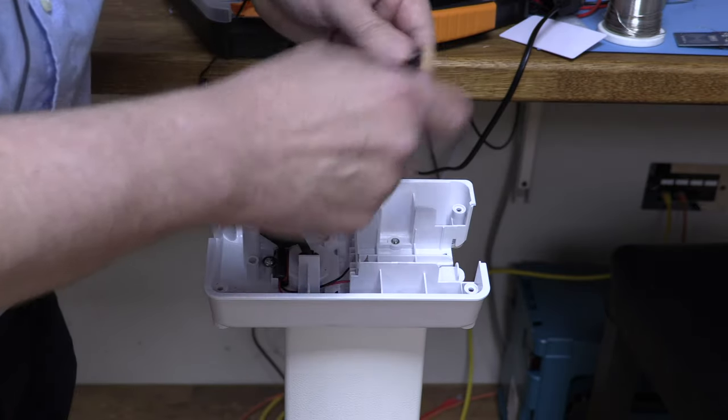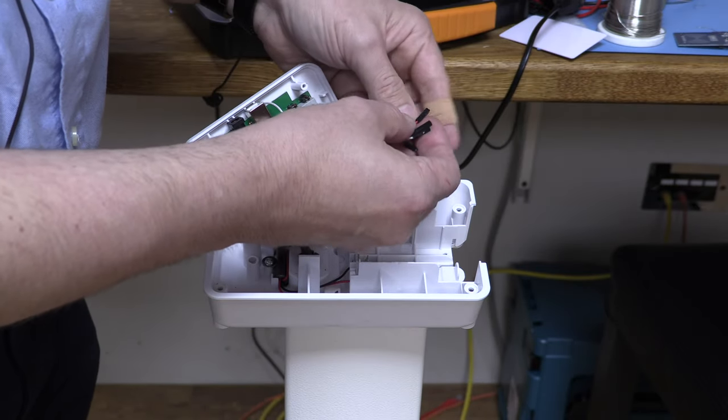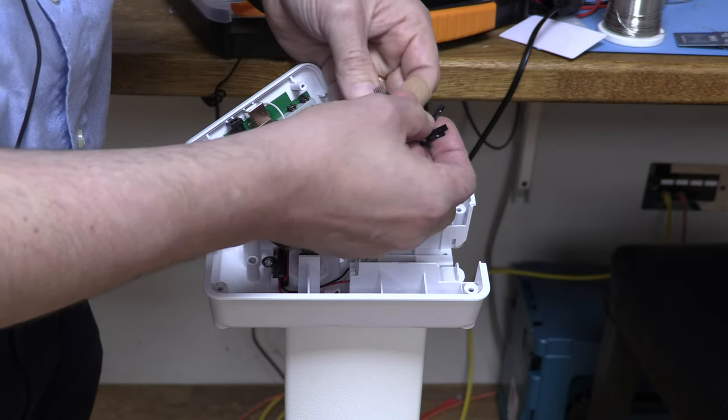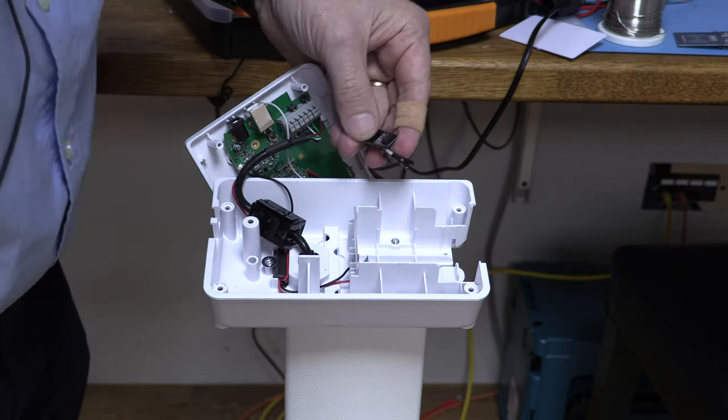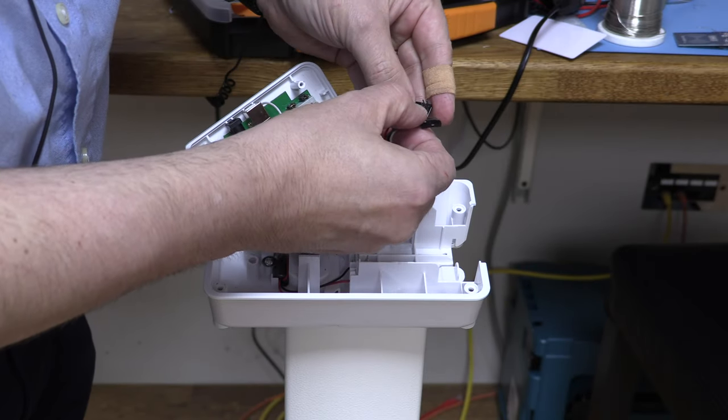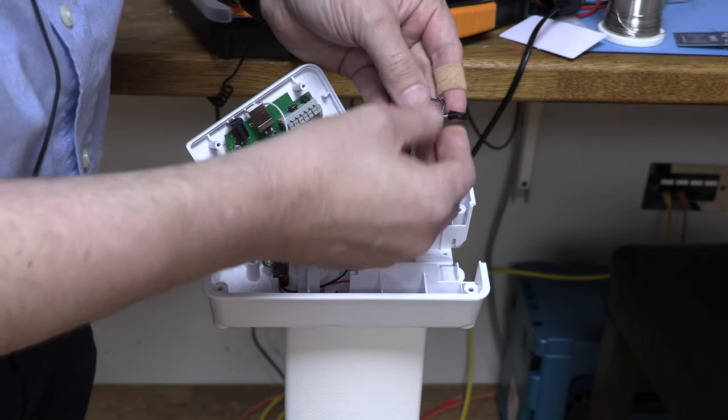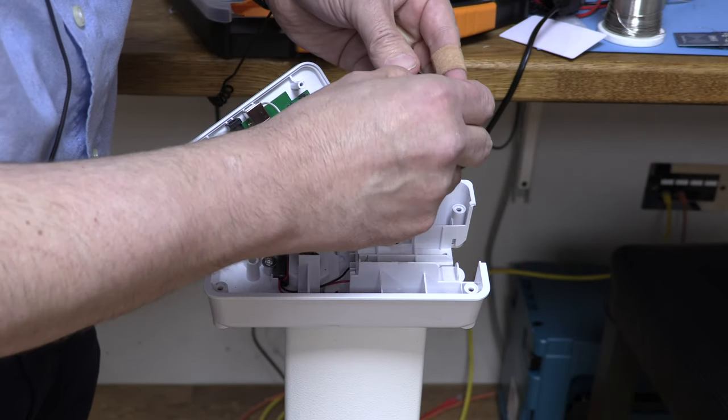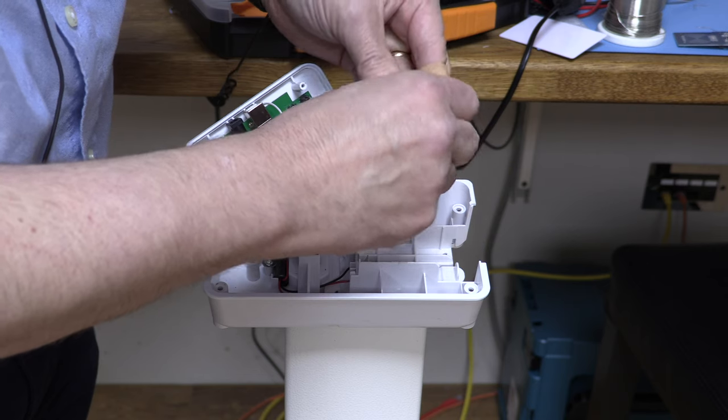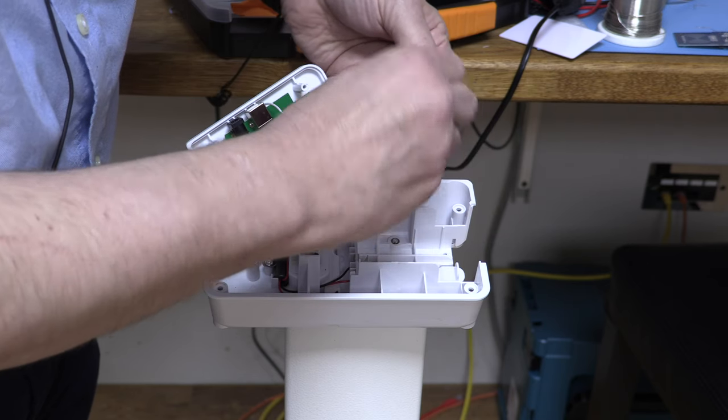And we connect it up to this. So we connect five volts which is the red one. We connect ground which is the black one. And we connect receive data which is the white one.